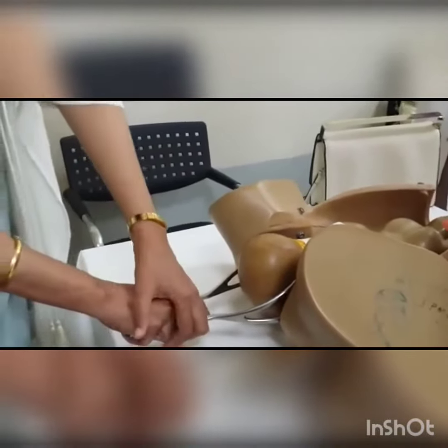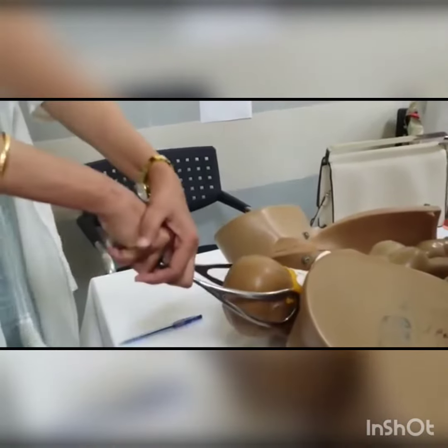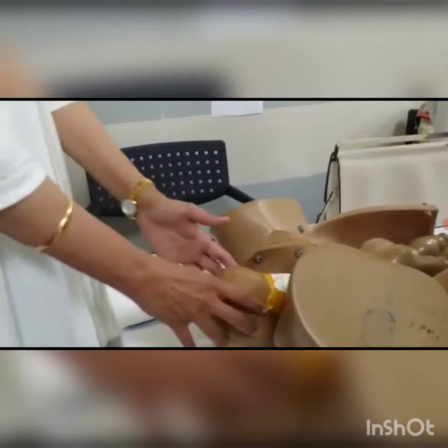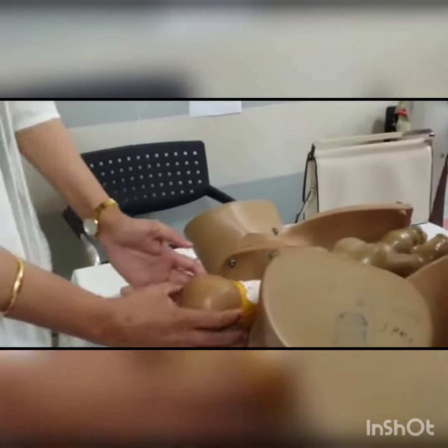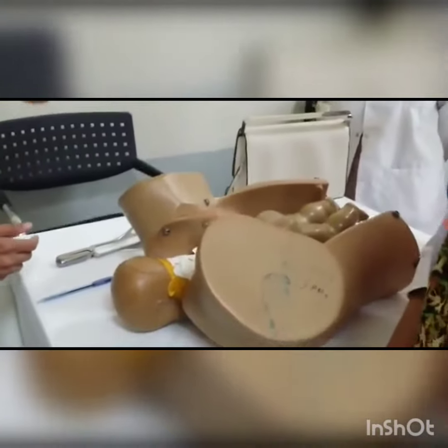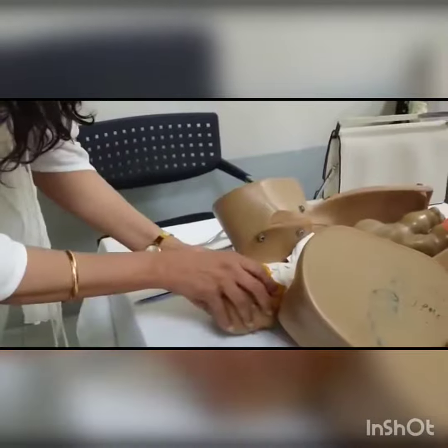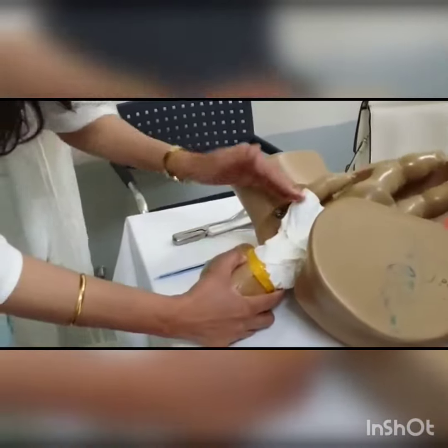Move your hands with the forceps in the downward direction and then in the upward direction. When the head is out, do not pull it — let the internal rotation of the shoulders occur, and assist the rotation of the head. And this is it — the baby will come out easily.